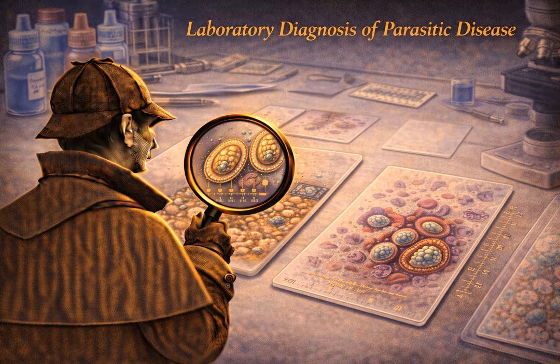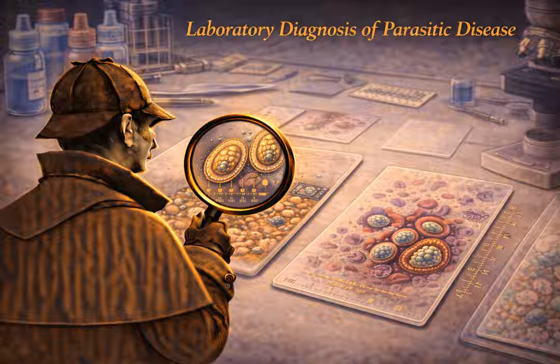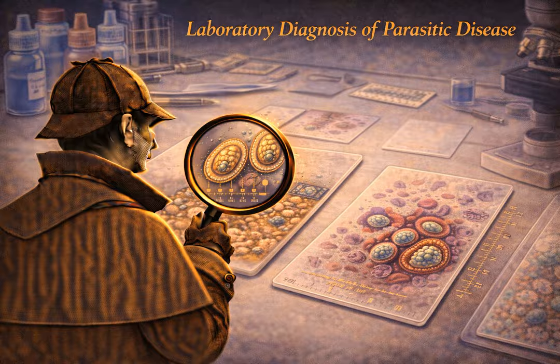That's perfect. What about Entamoeba histolytica? How do we positively spot the killer amoeba? The absolute pathognomonic feature for the E. histolytica trophozoite is ingested red blood cells. If you see an amoeba and inside its cytoplasm, you can clearly see intact human red blood cells that it has eaten, that is E. histolytica, period. It is the only intestinal amoeba that actively phagocytoses red blood cells. So that's the definitive proof of tissue invasion. Yes. It is literally caught red-handed. If you see that, you don't wait. You start treatment immediately. Caught red-handed, I love that.